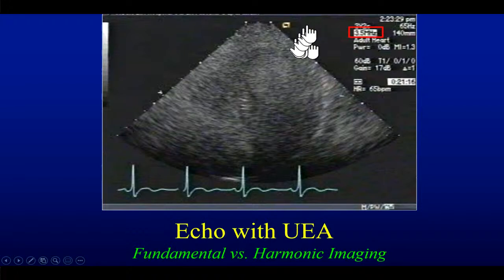Okay? So let's see. Since now it's still picture without harmonic, notice that contrast is there already. You cannot even tell the difference between the myocardium, you barely can tell it. This is an apical 4-chamber view, and contrast here. They all blend. They're almost the same, okay? So basically, you're not enhancing the contrast portion, and you're not really using contrast for its best advantage. And if I turn on H, you will see instantaneously, the image is different. Okay, let's play it.